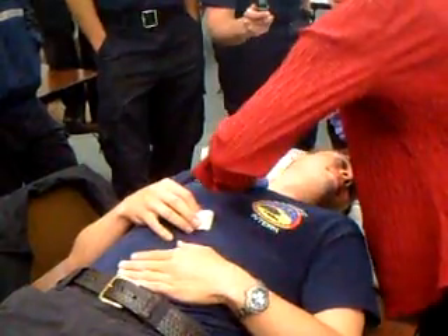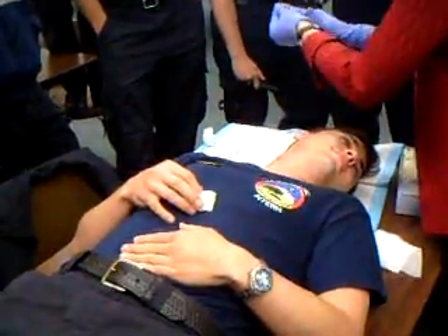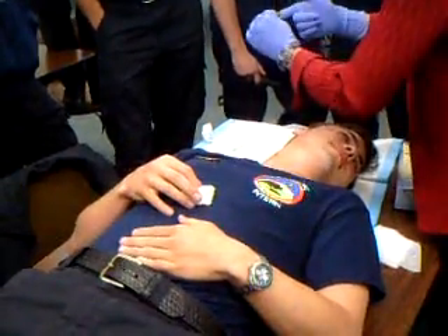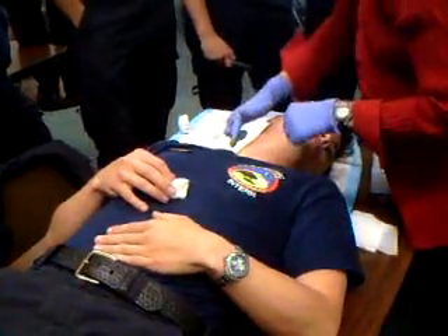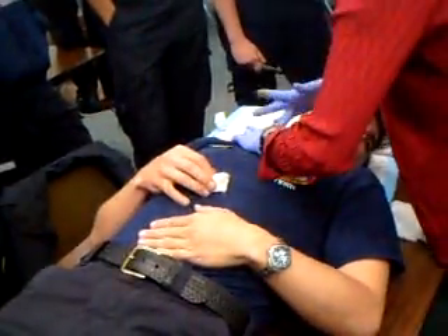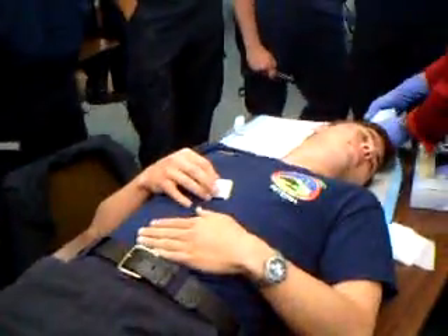So basically, I don't want to put my finger back in there, but what you can do is go like this to your own gloved finger, and then you can palpate it all you want — because you can have a juicy one. I can go like this. I can see it right there. I do want to wait until it dries. You want to blow it, right?